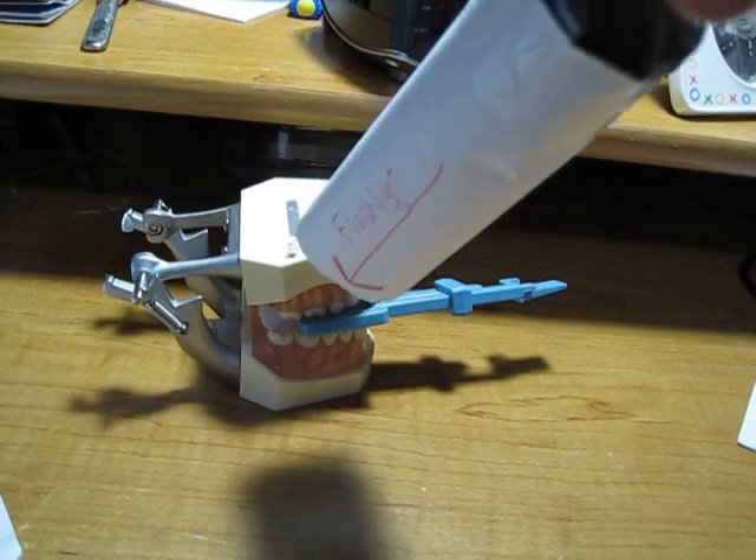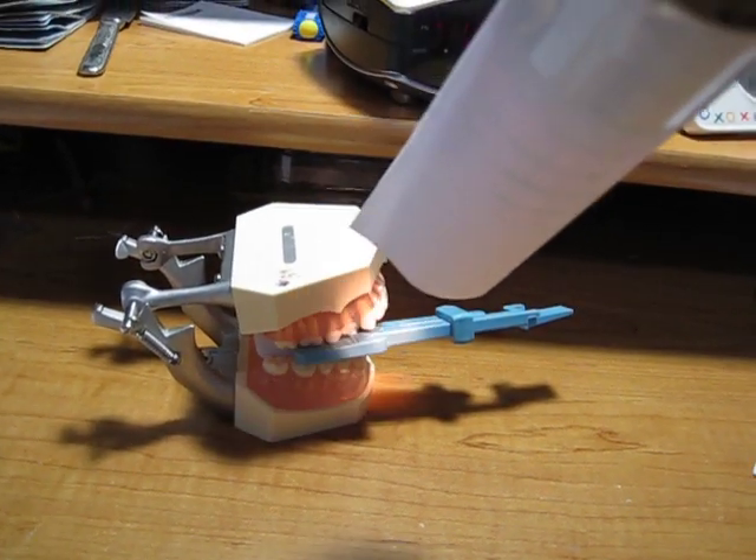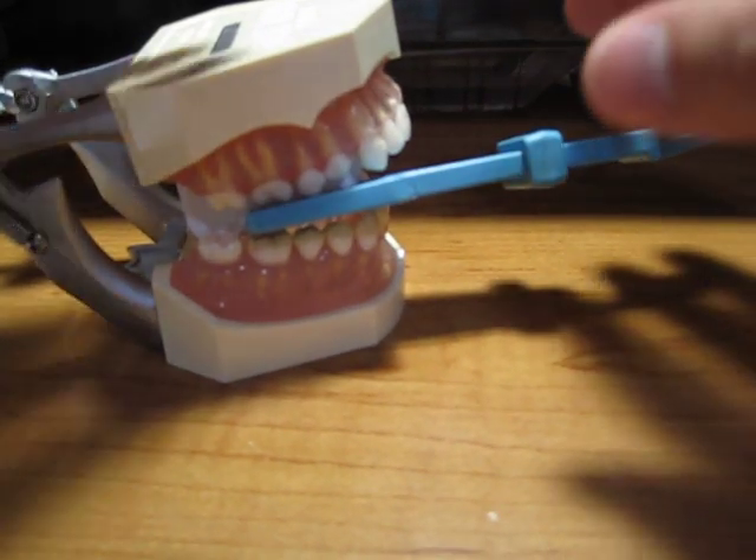So you would put your x-ray tube right there and expose the x-ray. That would be for the upper.